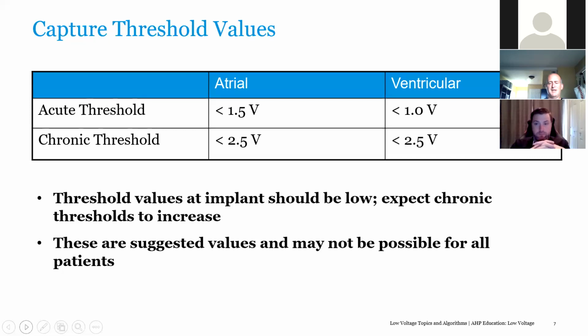Let's say our typical batteries last 12 years in our pacemakers. If we have a high threshold, that can reduce the longevity up to 40%. So we're trying to maintain so we have the least amount of interventional surgeries as possible for that patient.